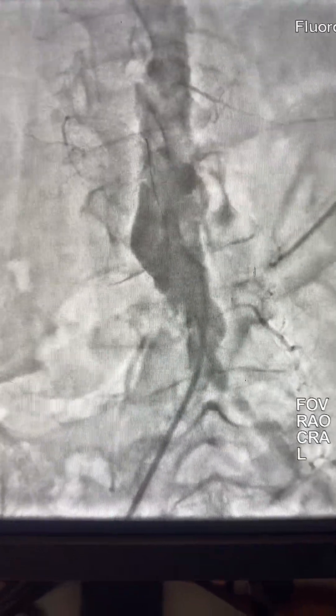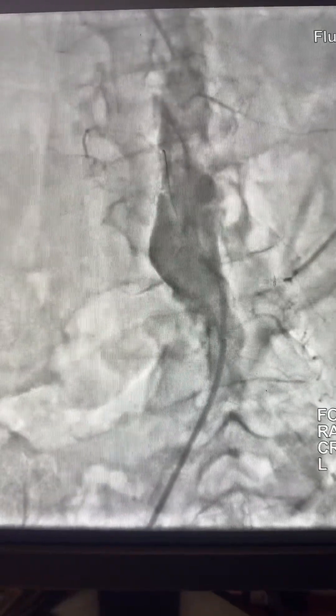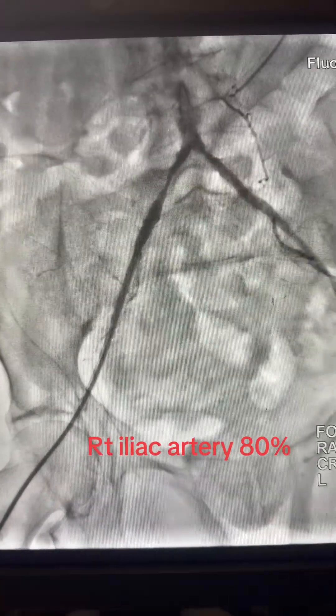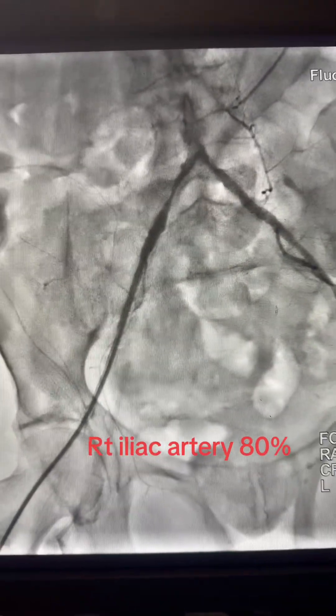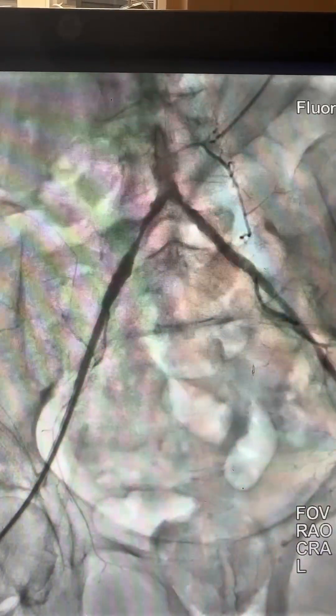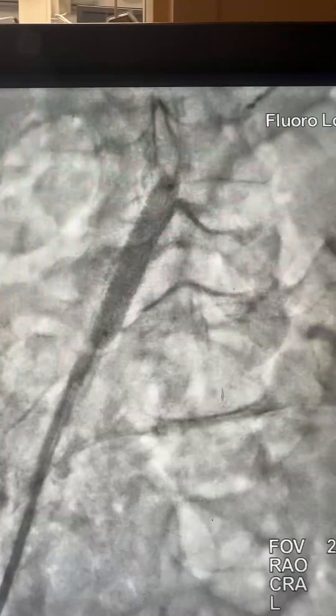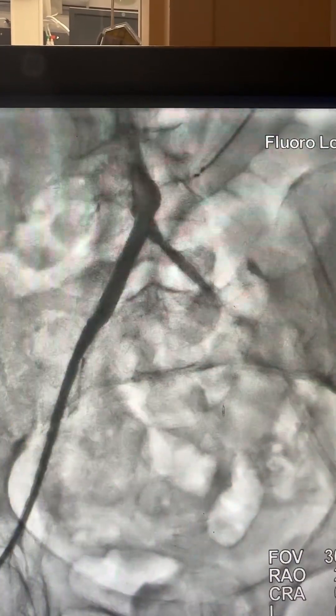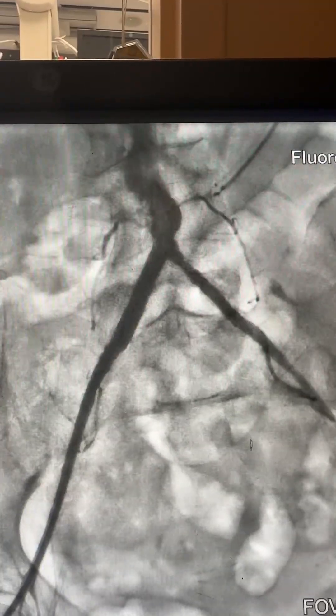Here is the angiogram of the distal aorta, which is ectatic. We have a tight lesion here, and that's why we don't have a pulse in this leg. There is a tight lesion in the common iliac artery. During CPR, I have two central lines in the femoral arteries, right and left. I perform a 4.0 balloon dilation toward the iliac, then angiogram to determine where to place the stent. We can place it up to here.